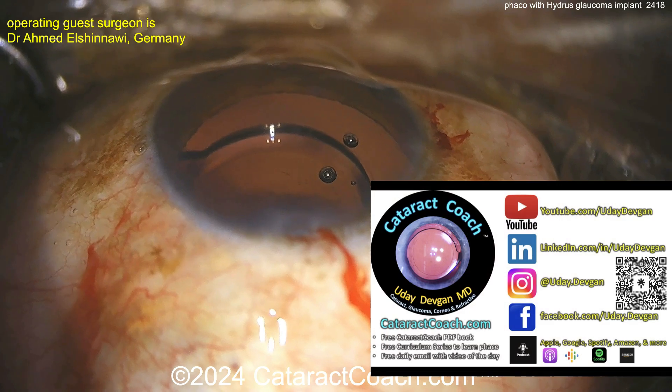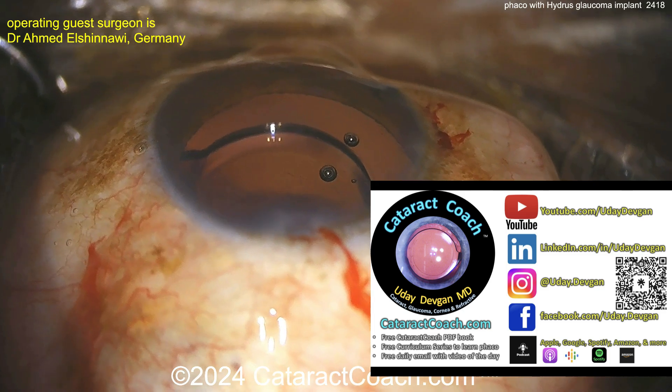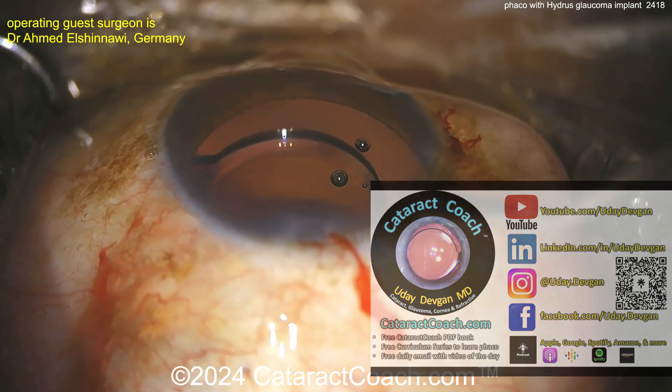Here's the case: the patient's already had the faco done, you can see the lens in the bag. By the way, check out our podcast — the top podcast of all ophthalmology. It'll make you more successful in your career.